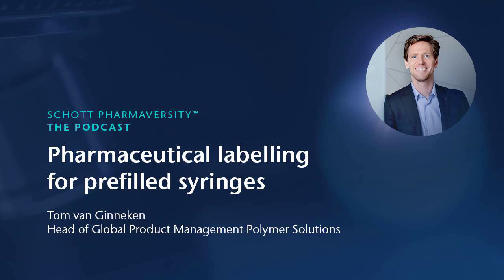Yeah, good question. Absolutely. As just mentioned, the COC material is a semi-permeable polymer. So in theory, yes, substances can penetrate through the material. And the rate at which this migration can happen depends on the size of the molecules. That's similar to the oxygen story. Oxygen is a really small compound, so oxygen can permeate through the COC material. That's why we investigated to see that none of the compounds coming out of the glue or the label would penetrate through the wall and ultimately impact the efficacy of the drug.